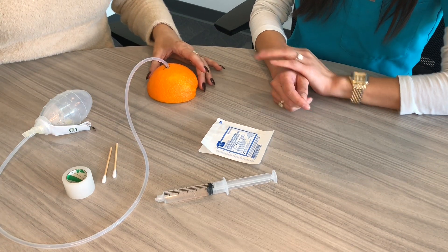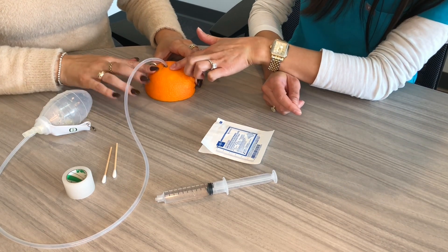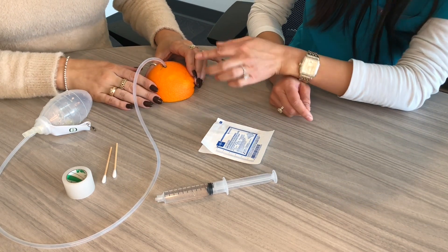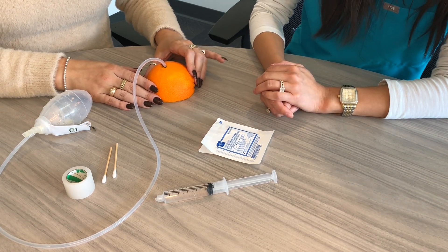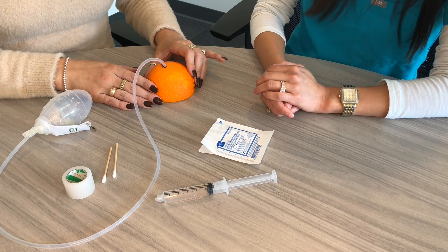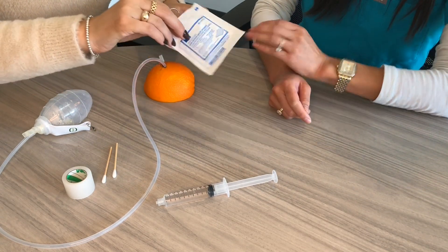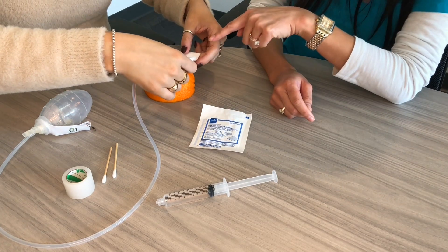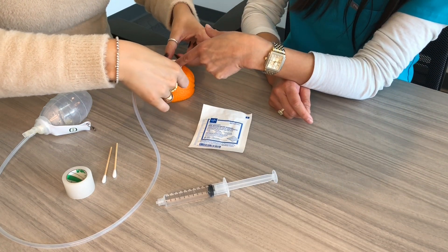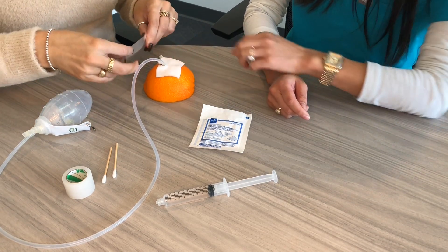Check the skin around the drain to make sure it's not red, tender, or swollen, and also check that there's no drainage coming from around the tube. Then place a clean dry gauze over the drain tube site and secure it with tape. Sometimes there's a slit in the gauze, which is perfect. If not, you can use scissors to make that slit before putting it on.